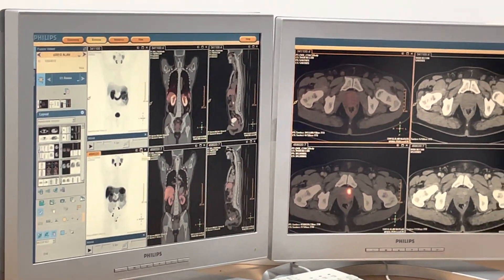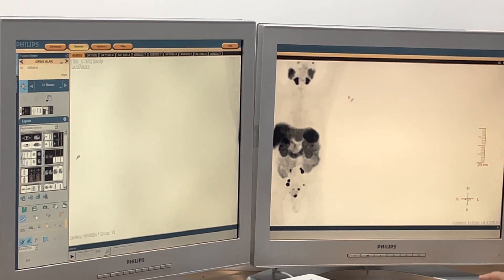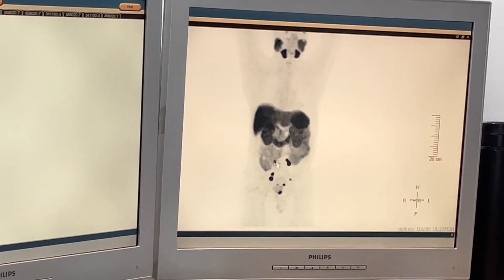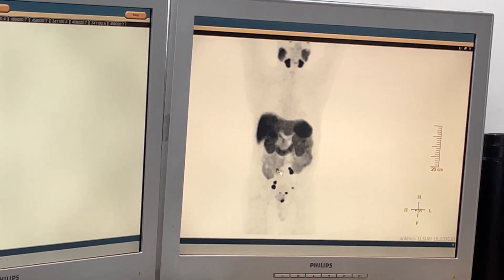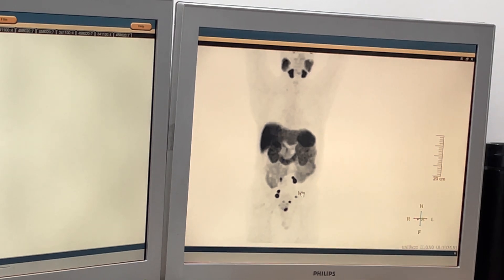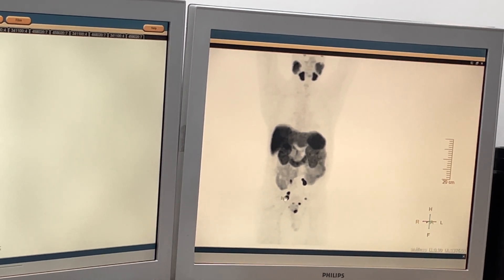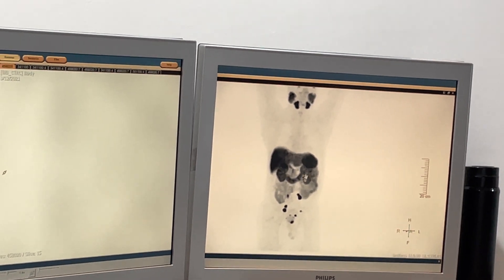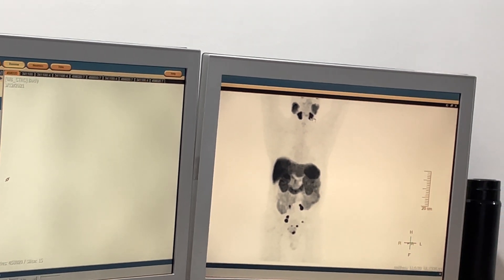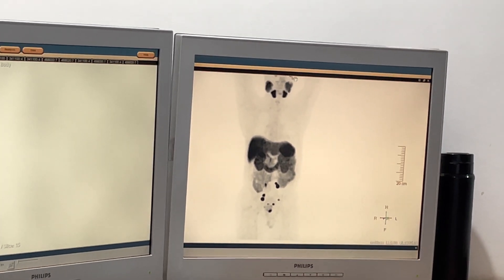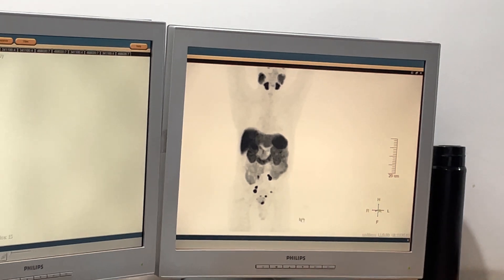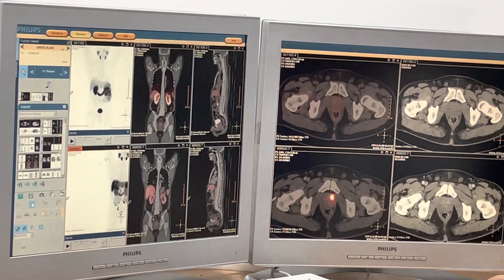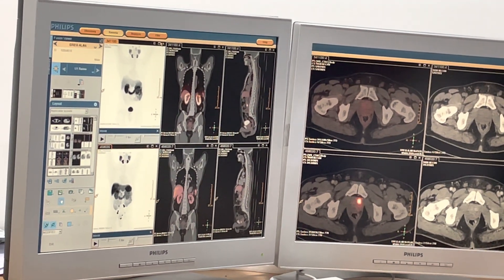If you look at this MIP image — I want to just blow this up — you can see these were all the spots. This was the spot in the prostate gland, and these were all the spots in the pelvic lymph nodes, all these little black dots. There are about ten of them. This is the kidneys — normal distribution — the liver, the spleen, the small intestine, the salivary glands: the sub-mandibular glands, the parotid glands, the lacrimal glands. The disease was all confined to the pelvis and just a little bit beyond.